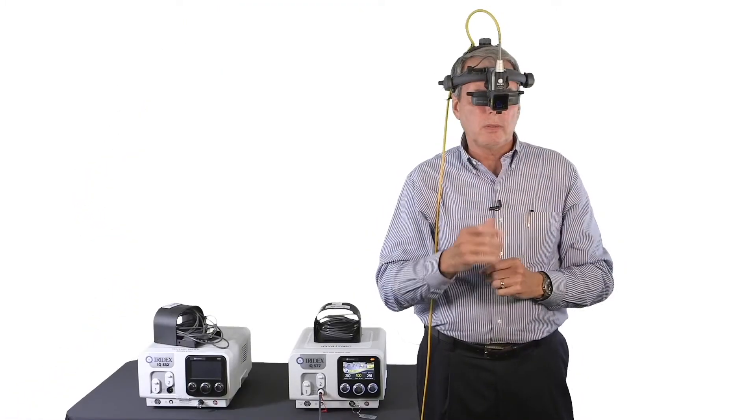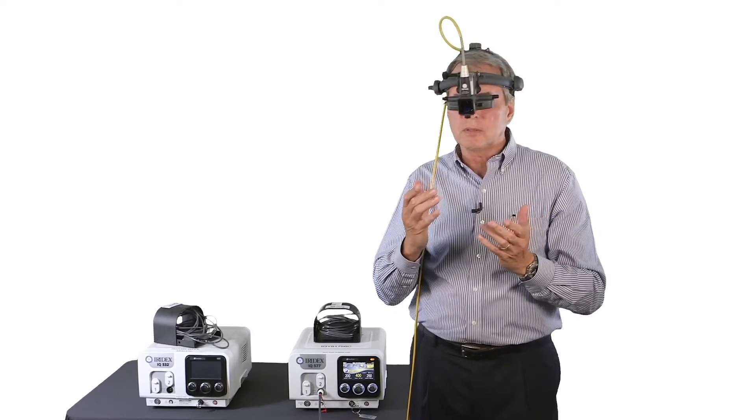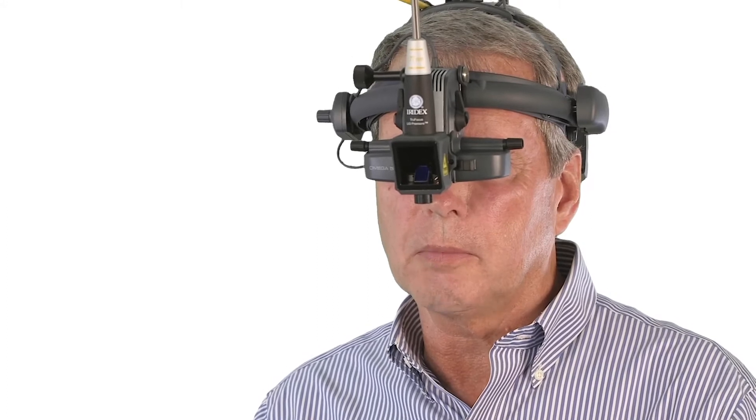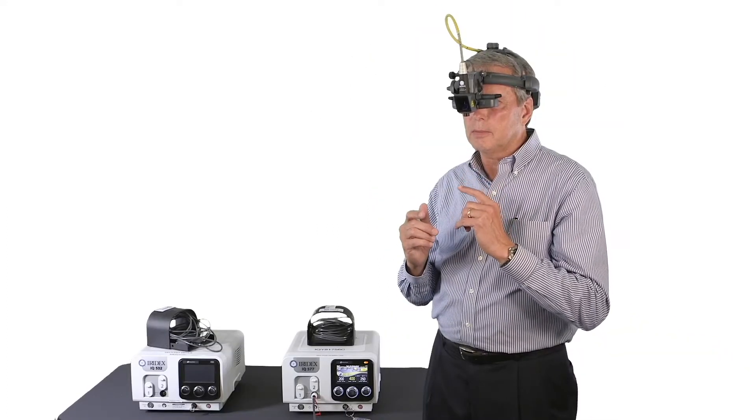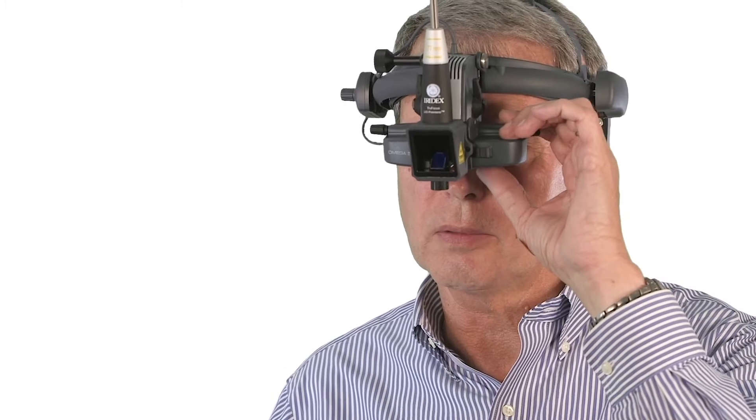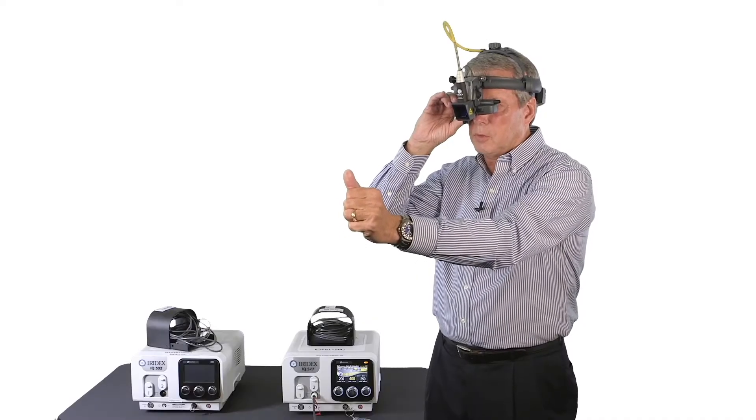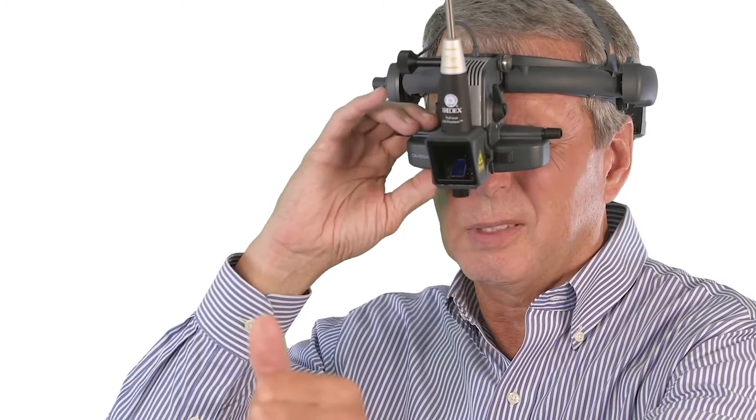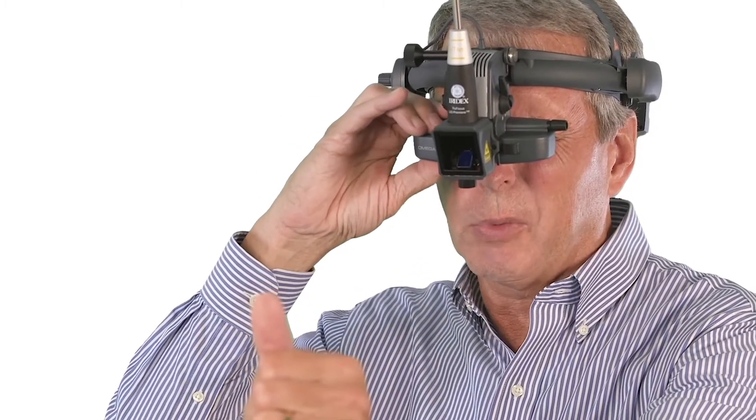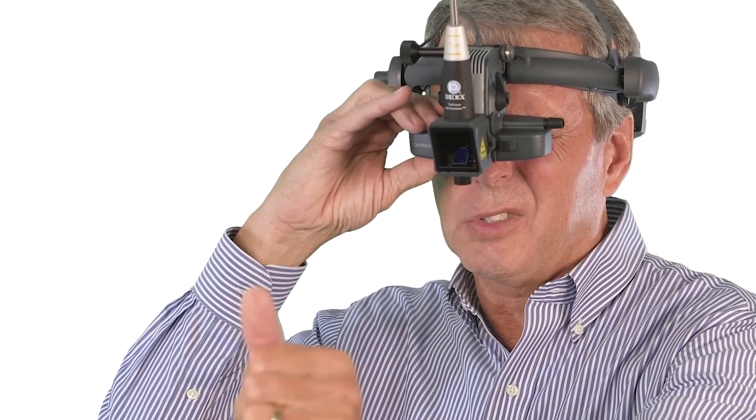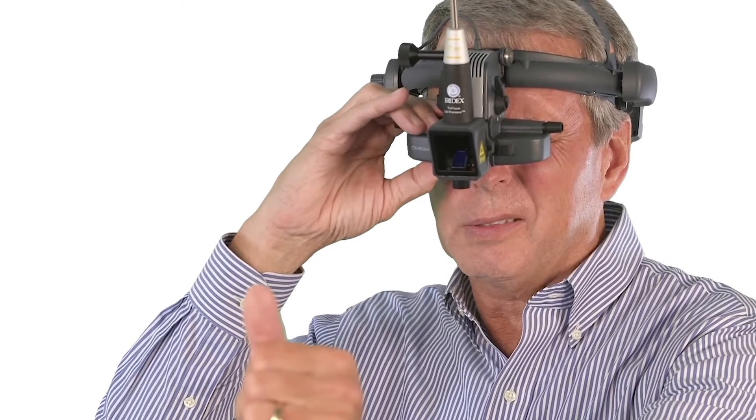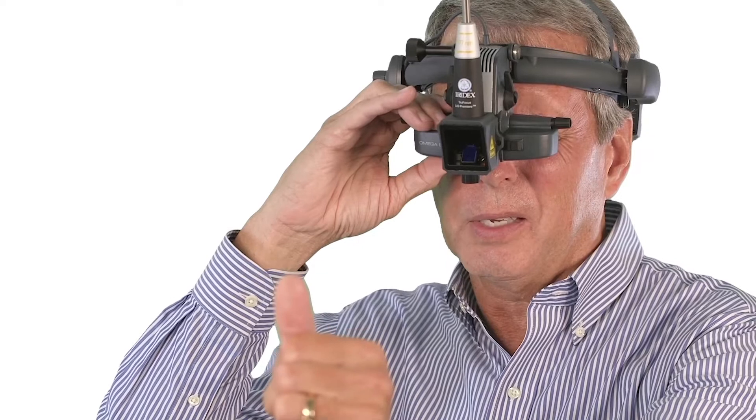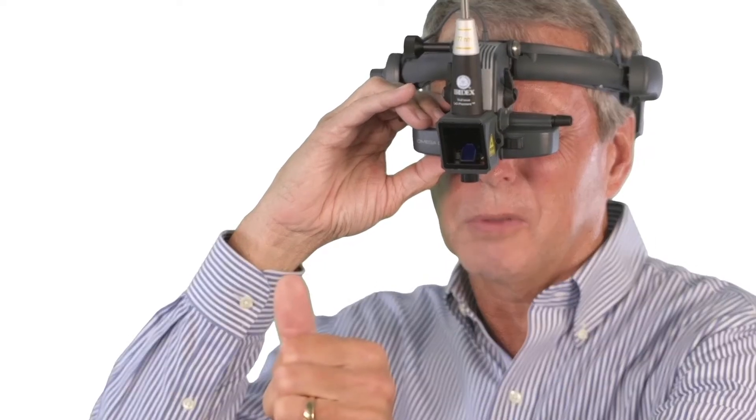At this point, you want to set the pupillary distance. What you want to do is adjust one ocular at a time since they work independently. You'll close one eye, adjusting the right ocular, about a 15-inch focal plane from your thumb to the optics body. Close the left eye, keep the right eye open, and slide the ocular left or right until you have your target in the middle of your field of view.